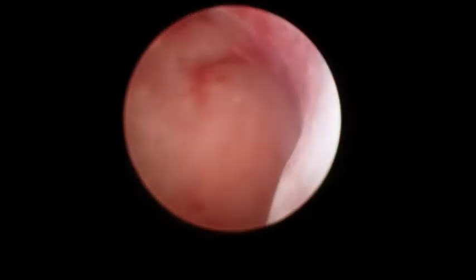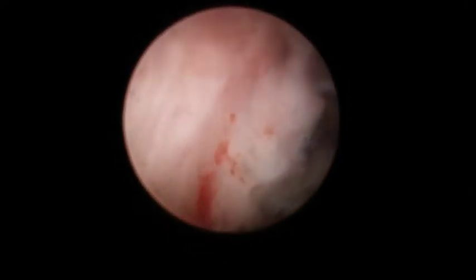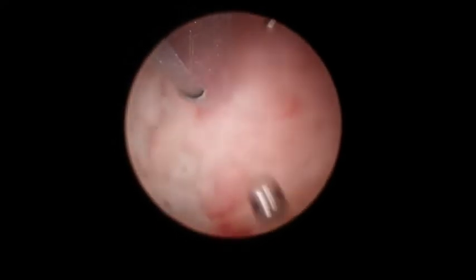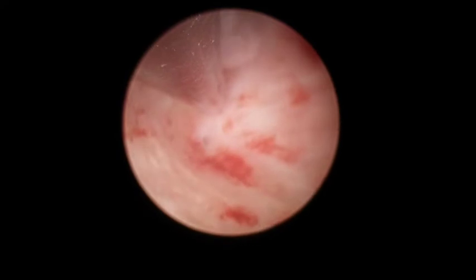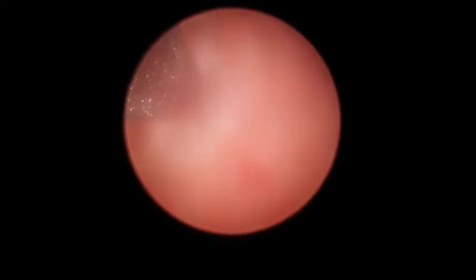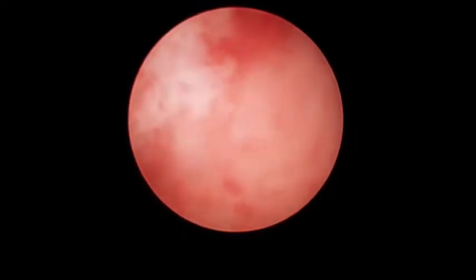As you can see, the majority of the fibroid appears to be removed, and only the base of the stalk is remaining. In efforts to resect the base, brisk bleeding is encountered. The flow-by technique is attempted — the scope is brought close to the bleeding to let high-flow saline clear the field — however, the bleeding is too brisk.